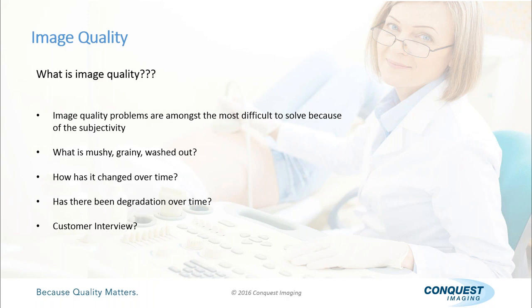And that really relies on what we call a customer interview. You need to really speak with the sonographer when they're talking image quality, because it is such a subjective thing that we encounter from day to day. As a matter of fact, I have actually changed customer interview to customer interrogation, because it seems like I just never have enough information when it comes to troubleshooting image quality.